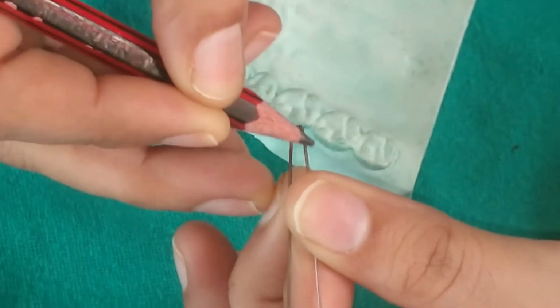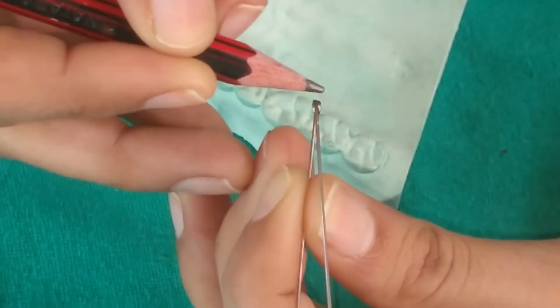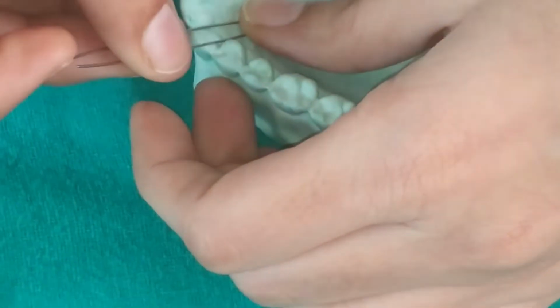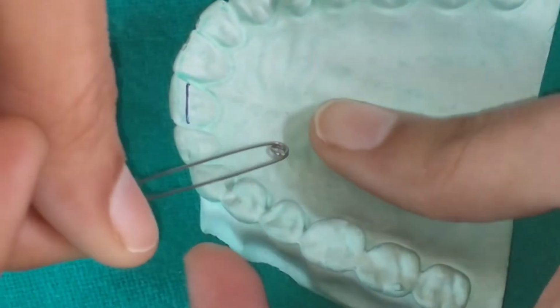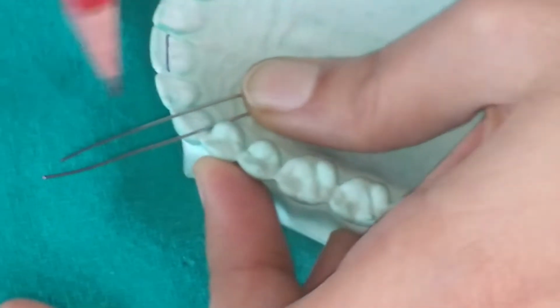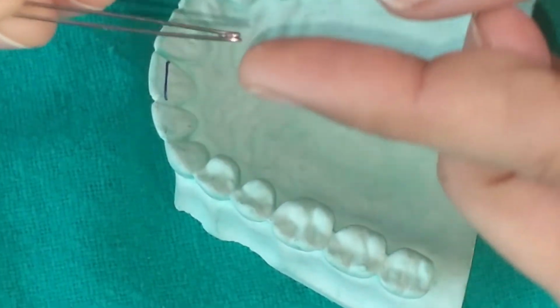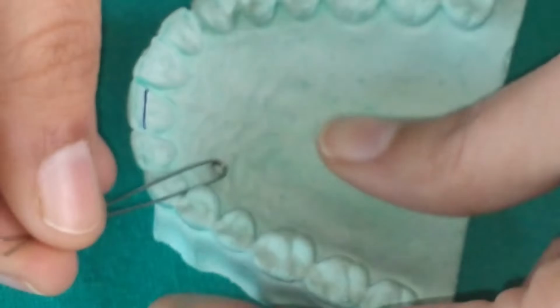It is very important to understand that the wire which is tissue side or inside will be the active arm, and the wire which is outside will be the retentive arm. Second thing, the wire which is inside should be distal to the canine and engage the mesial side of the canine. This distal wire should be tissue side and should engage the mesial side of the canine, and the wire which is mesial should be outside or away from tissue and will be bent as the retentive arm. This distal side is tissue side and will be the active arm. The mesial wire is away from tissue and will be the retentive arm.